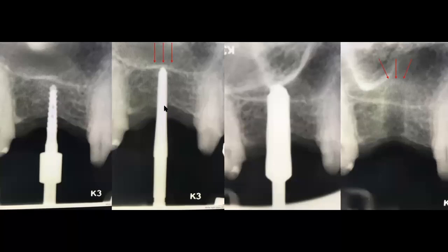And by using them in reverse, now I'm eliminating the actual cutting features of the drills and just creating this pushing of bone towards the side and apically, and I'm going to also densify using these drills. And these drills are specifically designed to do this procedure. So this is now the widest drill that I was able to use. This is the 4.0 within that Versa kit.